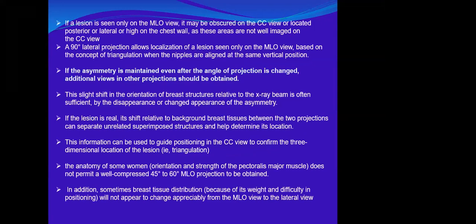Do you know when we use the straight lateral view for triangulation? We described this in the positioning lectures. We use it to triangulate a lesion which is seen in the MLO but not seen in the CC. Excellent.